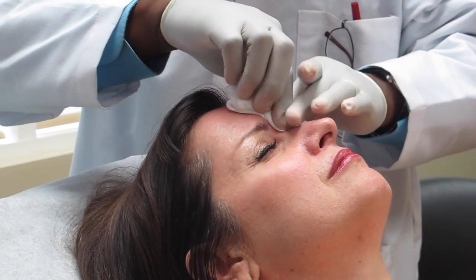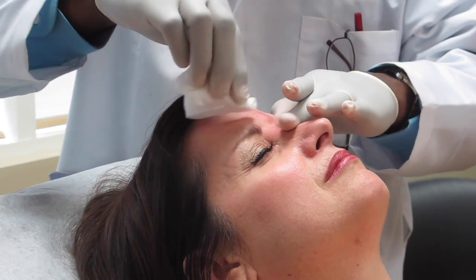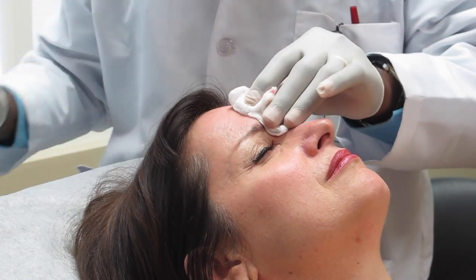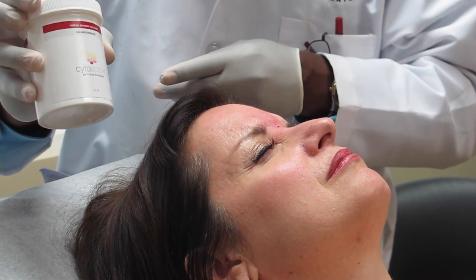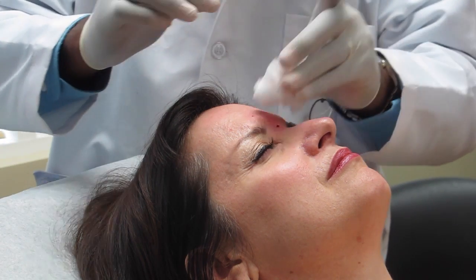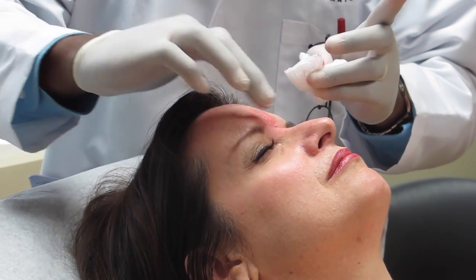There's a little bit of puffiness from the injection right afterwards, but that will go away in about 10 to 15 minutes. Right after, I like to use a little cytoactive — it helps prevent bleeding and bruising later on.